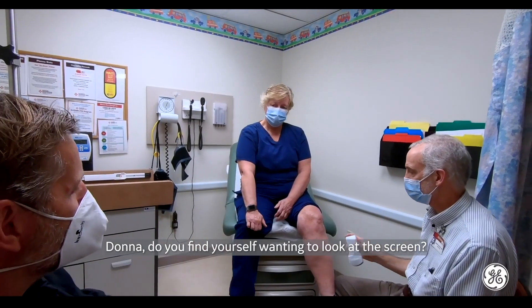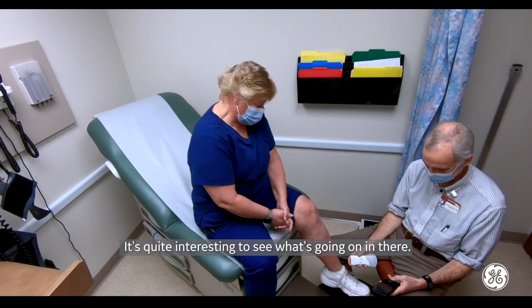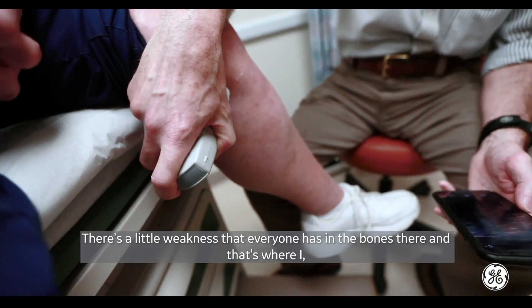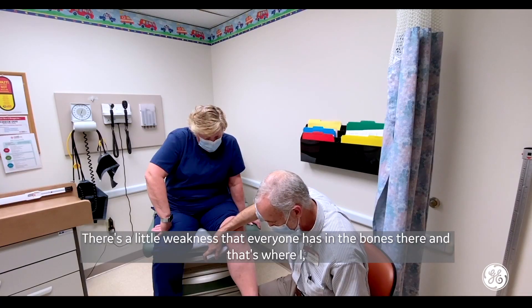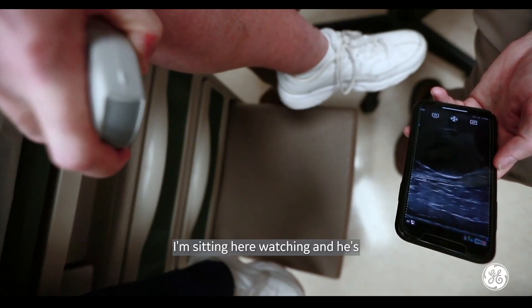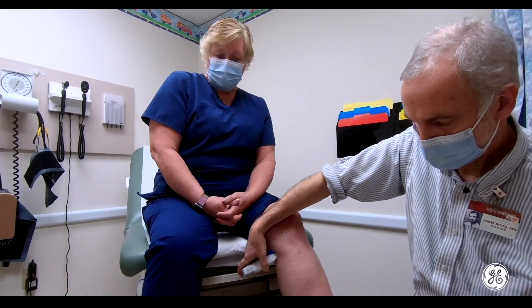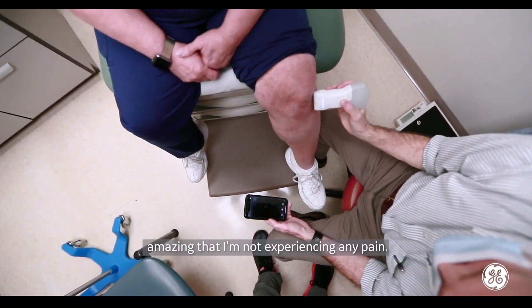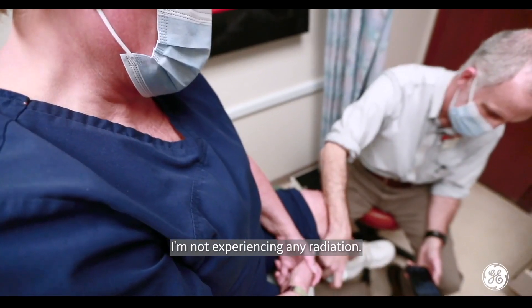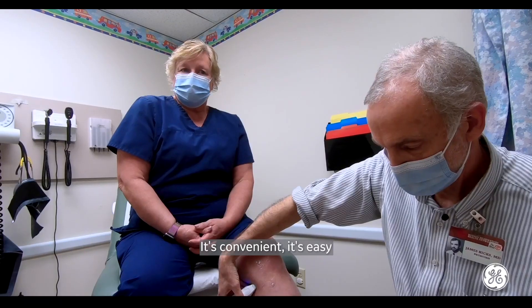Donna, do you find yourself wanting to look at the screen? Yes, I do. It's quite interesting to see what's going on in there. There's a little area where I see this fluid for you because we're looking straight through the knee. I'm sitting here watching and he's discussing and telling me what he sees. I think it's amazing that I'm not experiencing any pain, not experiencing any radiation, it's not taking a lot of time — it's convenient and it's easy.